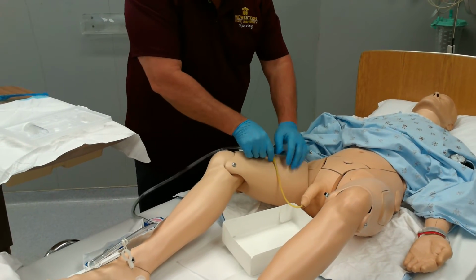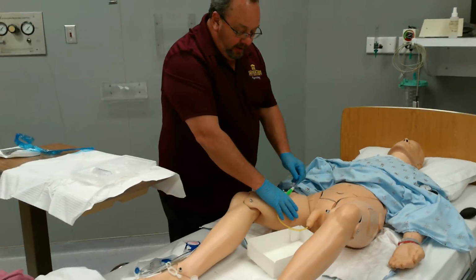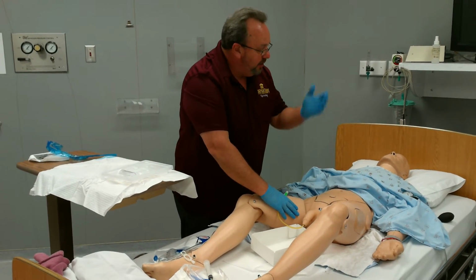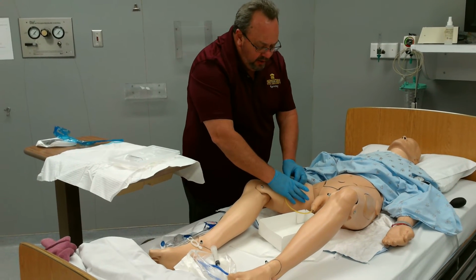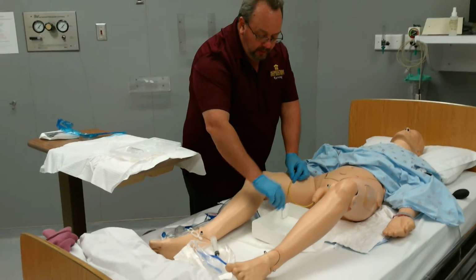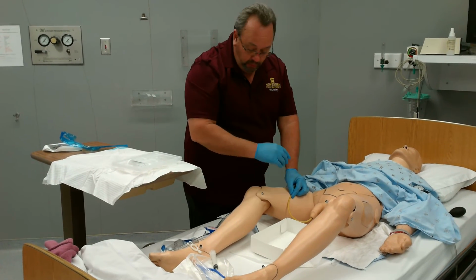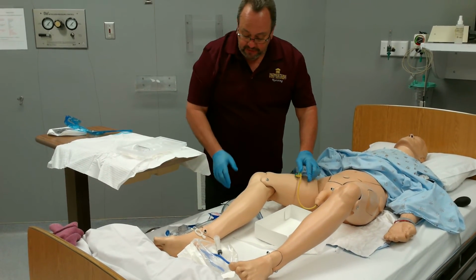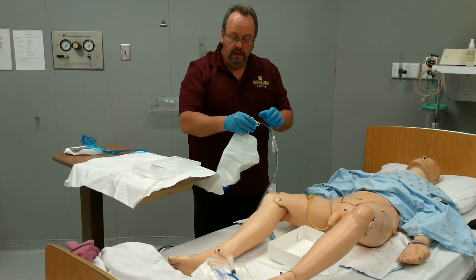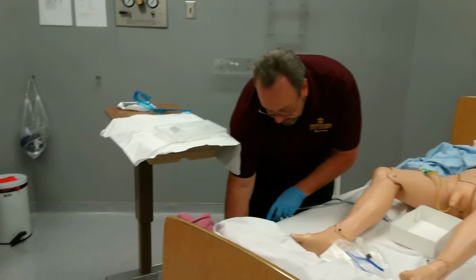with some tape right here, or a securement device, such as a Foley securement device that can stick to the skin. But a good piece of foam tape would be good here, just making sure that you have enough slack in there that you can get the patient up and walk without it tugging toward the end. Then, once I've secured that, this goes to bed frame, not the bed rail, but bed frame. So I will put it on the bed frame.